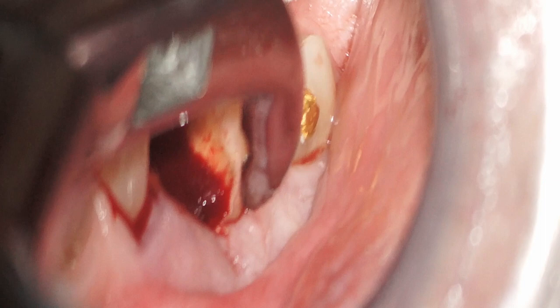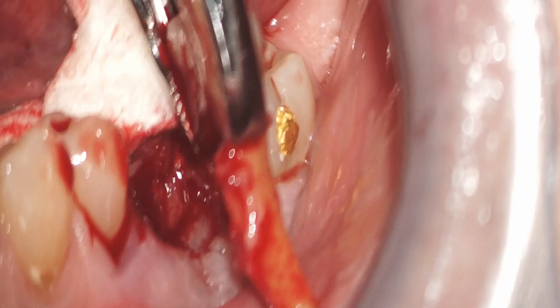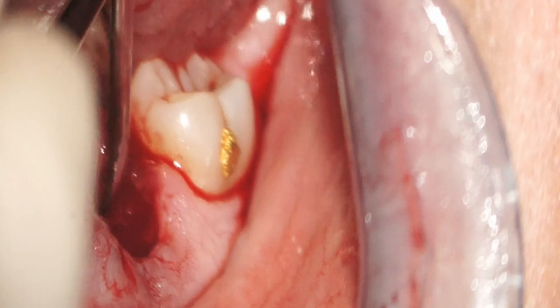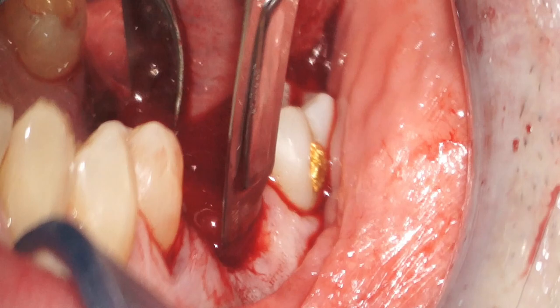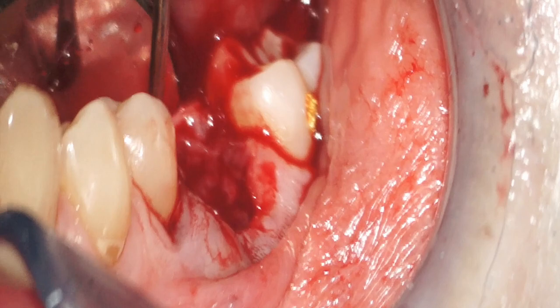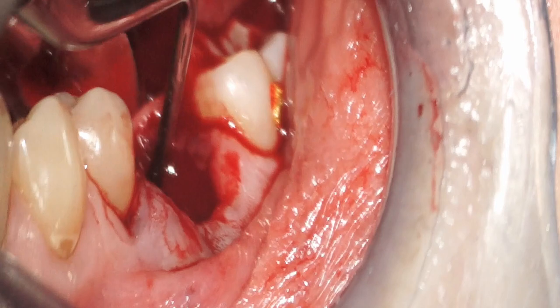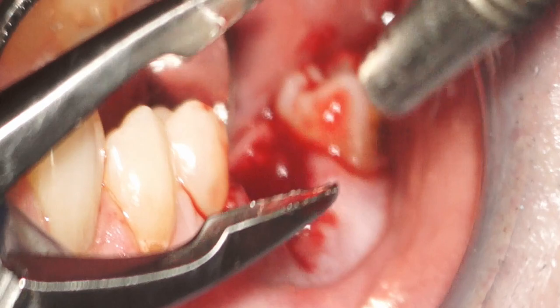We'll remove the roots atraumatically, and then our next challenge is to degranulate and debride the site. This takes some time, and we'll use a combination of spoon curettes, Gracey curettes, sterile water irrigation, and a 10cc syringe. In this case, because I have such a large soft tissue cyst, I'm also going to use a 15 blade to cut away some of the cystic defect. We want to completely remove all soft tissue down to the bone. I'll use 4.5x magnification loops and rinse or dry the defect with gauze, being careful with suctioning so as not to disturb the narrow papilla at the interproximal sites.